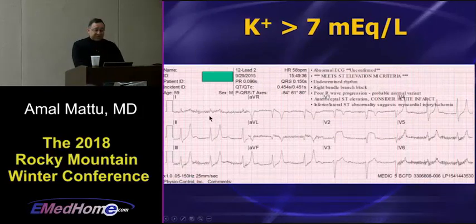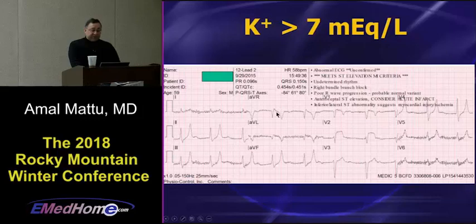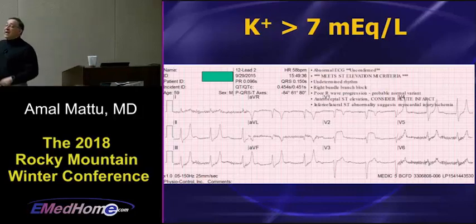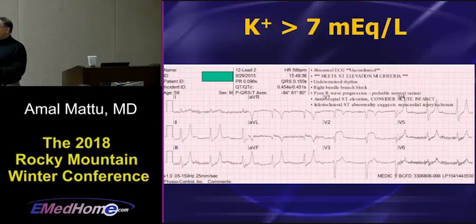Now here's another one. In this patient, there's no rightward axis to help you out, but again, ST elevation in the rightwardish leads, V1, V2, aVR, and hopefully you notice that there's peaking of the T waves. I've shown this to at least a dozen people. Probably only about half the people even notice the peaked T waves because they're so focused on the ST segments.